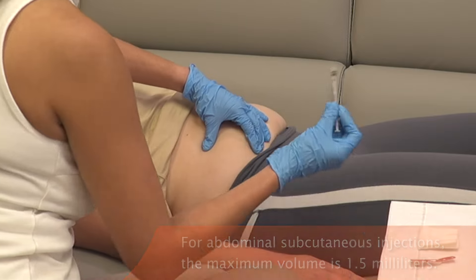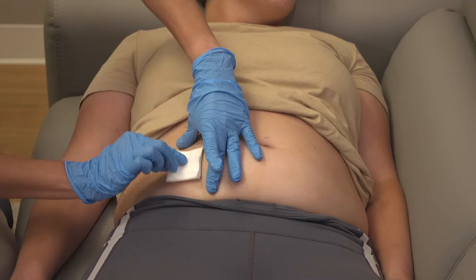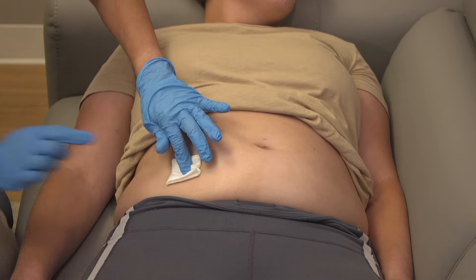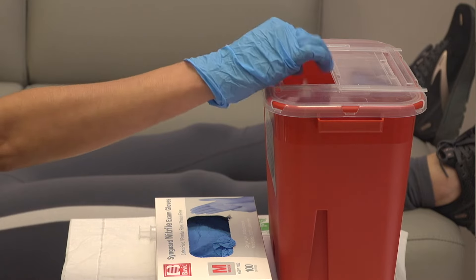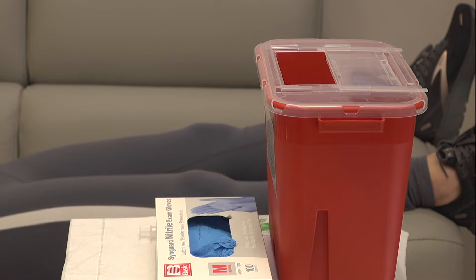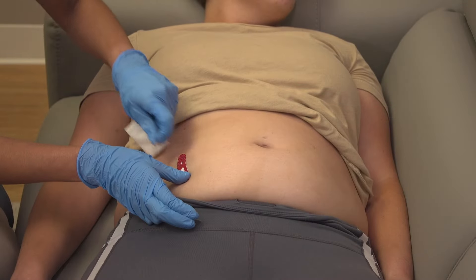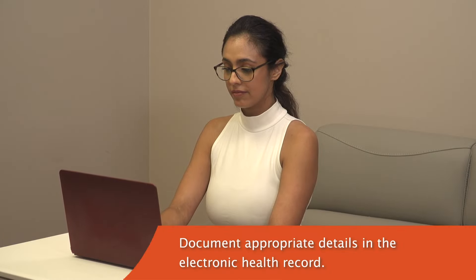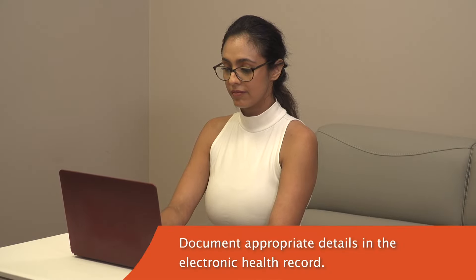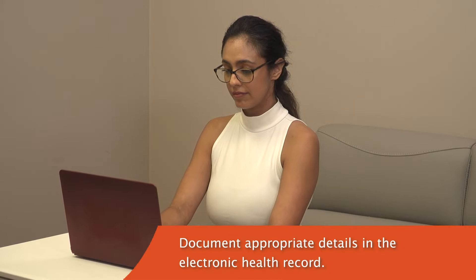Remove the needle from the skin and gently hold gauze on the injection site. Immediately dispose of the syringe and needle into an appropriate sharps container. Cover the site with a bandage. Document the procedure in your electronic health record according to any appropriate guidelines and protocols.